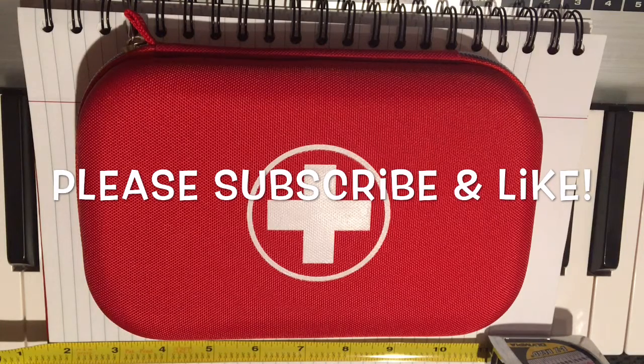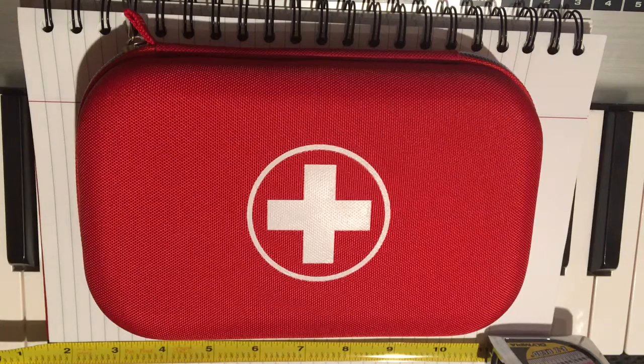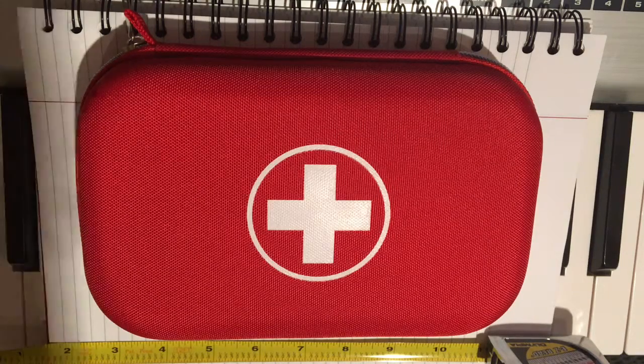Hey guys, it's Gearnut Jim here and I'm going to do a quick sort of unboxing, quick look at a first aid kit that I just purchased off of Amazon.